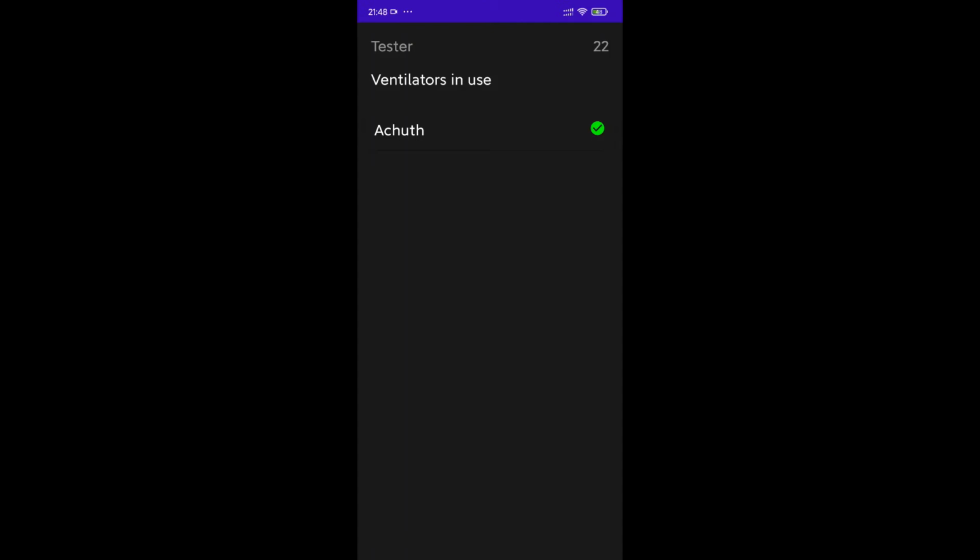In addition to the companion, it also creates a loud alarm that sounds both on the ventilating application as well as the companion. So it'll alert you even if you're not actively looking at the application to monitor any such discrepancies. And that's how we ensure fail-safe measures are followed throughout the application.